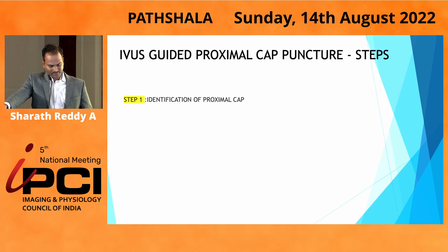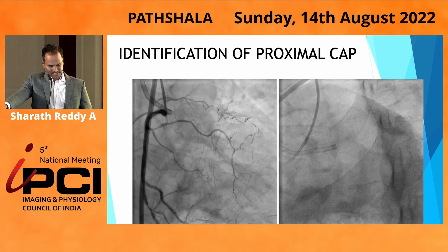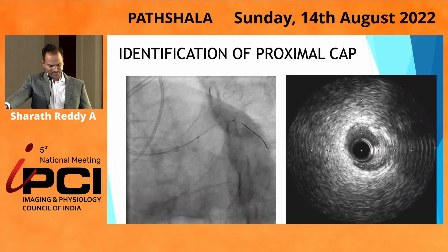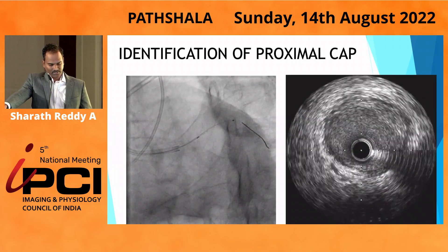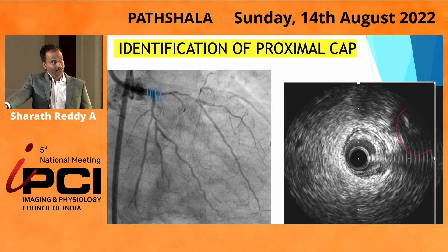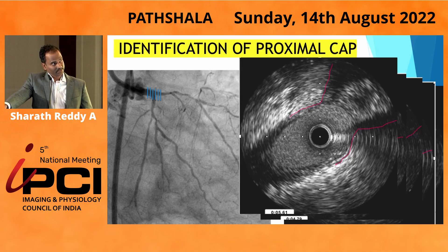The steps are: identification of the proximal cap, wiring technique, confirmation of central wire entry, then consolidate your position and move on. To identify the proximal cap, use a side branch close to your CTO vessel — in this case, the Ramus. On IVUS, you can see at three o'clock a shadow appearing and joining the main vessel. There is no shadow initially, then a shadow appears, and then there is fusion of these two shadows with no media visible between them. That fusion point is the proximal cap — that's where you start your wire.